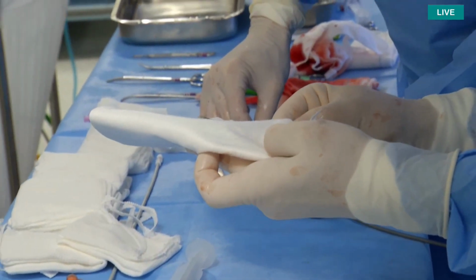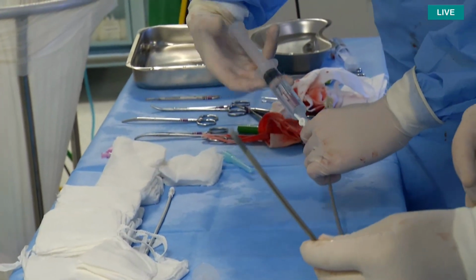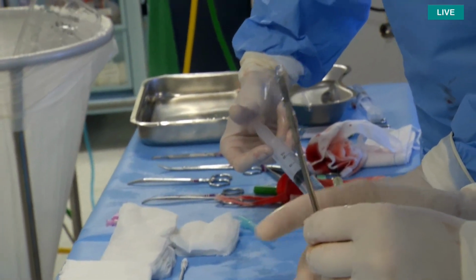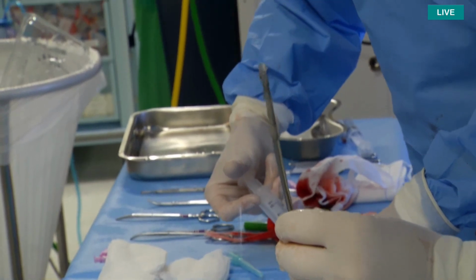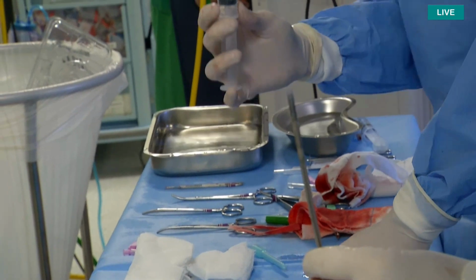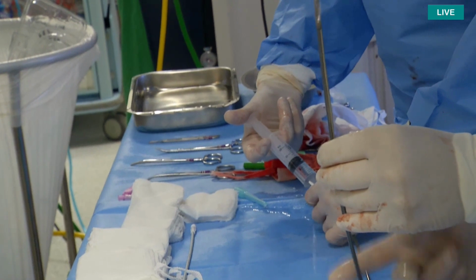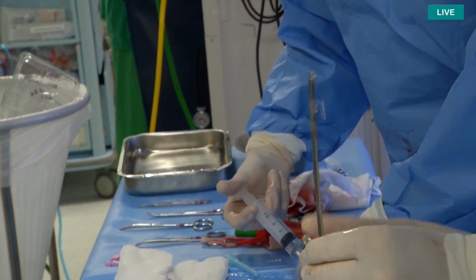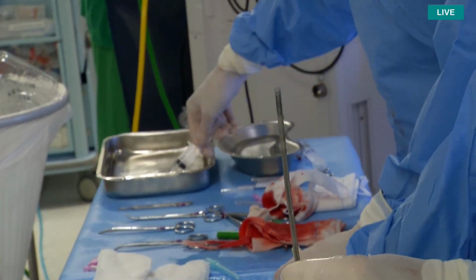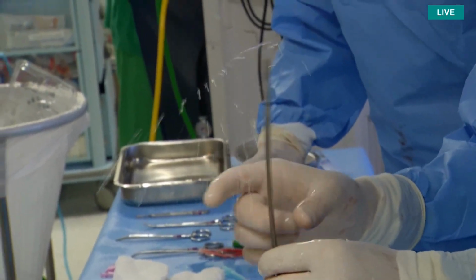What you can do if you have a very shallow appendage, not a deep appendage, you can even let it stick out a couple of millimeters. So that means you can push the device 2-3 millimeters beyond the ring. Now we're flushing. Wait, I'm going to take some extra flush. Okay, I'm going to close this here now. Now this is closed, the hub at the end. And now I really have to flush the whole catheter. That's a big one. Okay, that's maybe better.